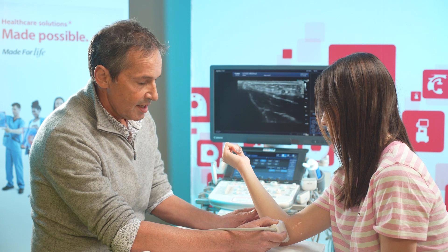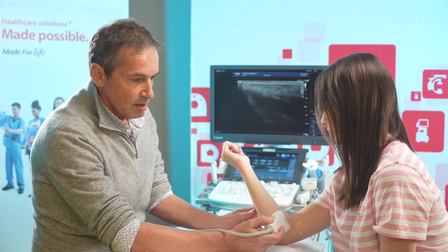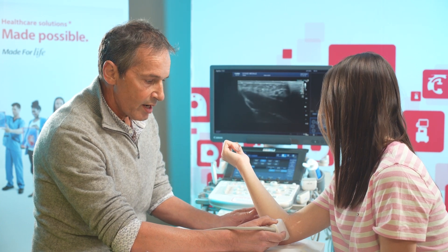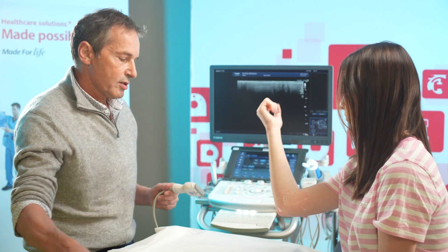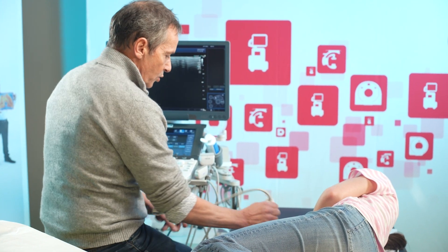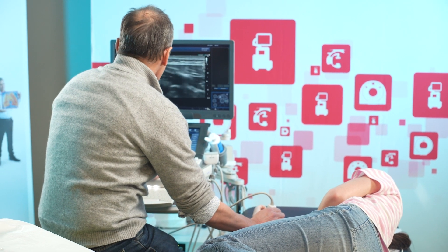You can use a small table across from the patient, which makes it easier to do a comparative exam. But since this is not always comfortable, I like to have patients lie on their side with the elbow flexed. This way, everyone is more comfortable to start the exam.